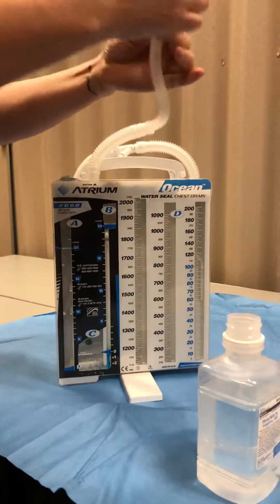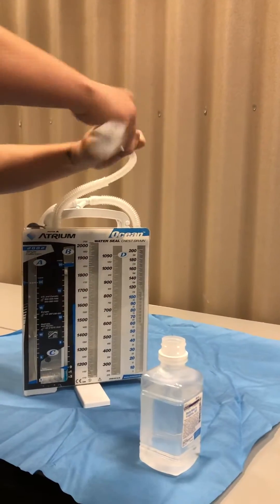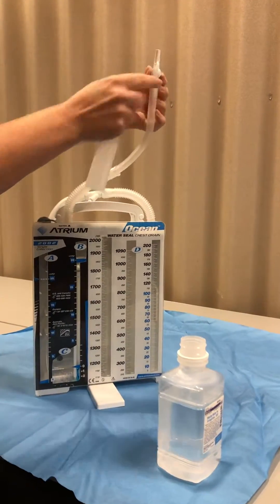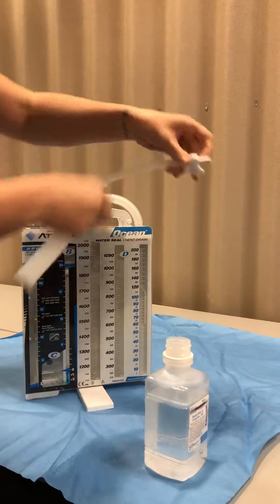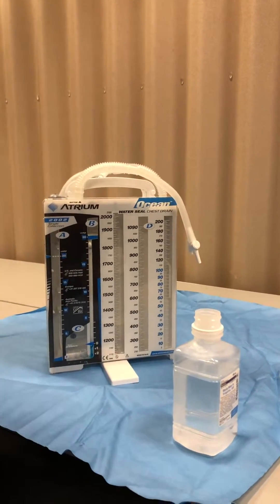Next, here is a little trick: you can take this off right here and leave this open. That has to stay open because that is where we're going to hook up suction later.